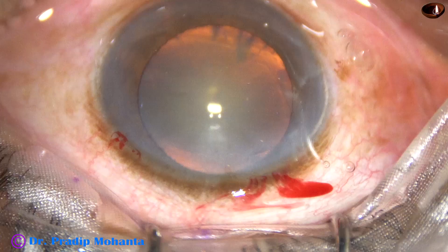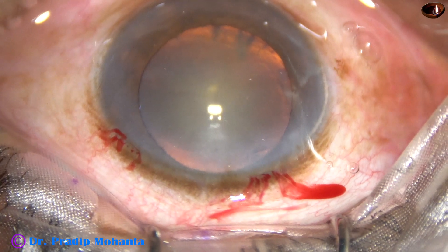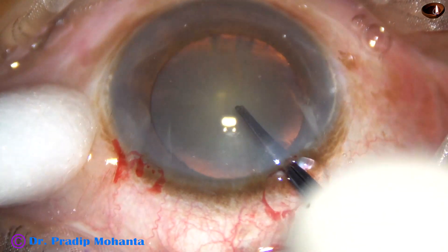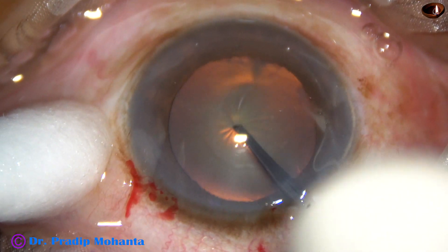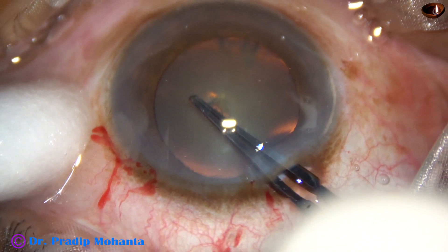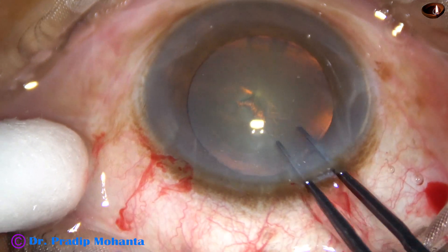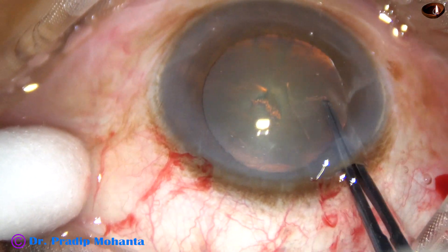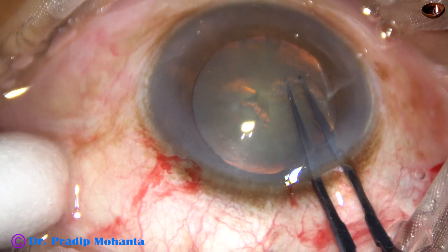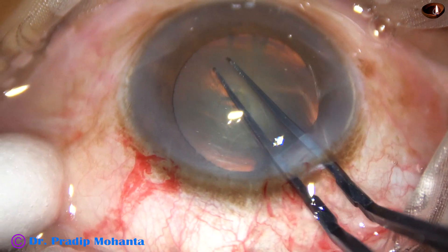Let us see this in slow motion. Viscoelastic has been applied over the corneal epithelium for better visibility. The utrata forceps is introduced. The tip of the utrata forceps pierces the center of the anterior capsule and moves to the left. A capsular tag is raised and held. By anti-clockwise movement, remaining at a certain distance away from the margin of the dilated pupil, an adequate-sized capsulorhexis is completed.